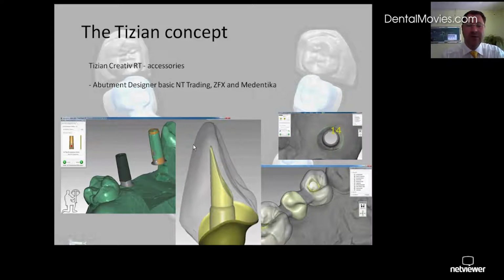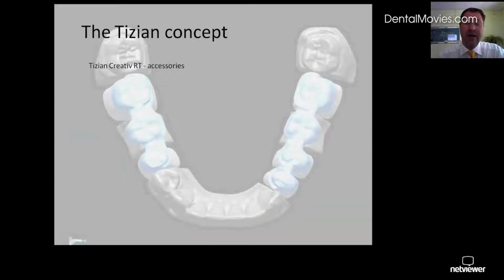And the big difference, if you have a 5-axis milling machine, you can do a complete zirconium abutment with a screw channel here from the top, because the 5-axis milling machine can do the different angulations in the screw channel. I hope that is a little bit clearer for you later on in the live demonstration, but please take an eye on the important part of 5-axis or 4-axis milling machine. But software-wise, it is the same, so all the steps on the software which we will show you are the same, and later on you have to decide which milling strategy you can perform.